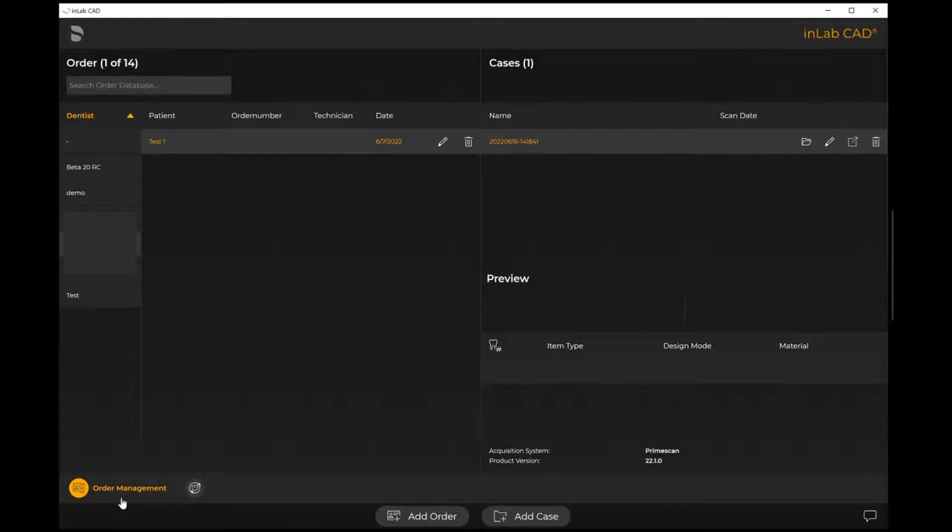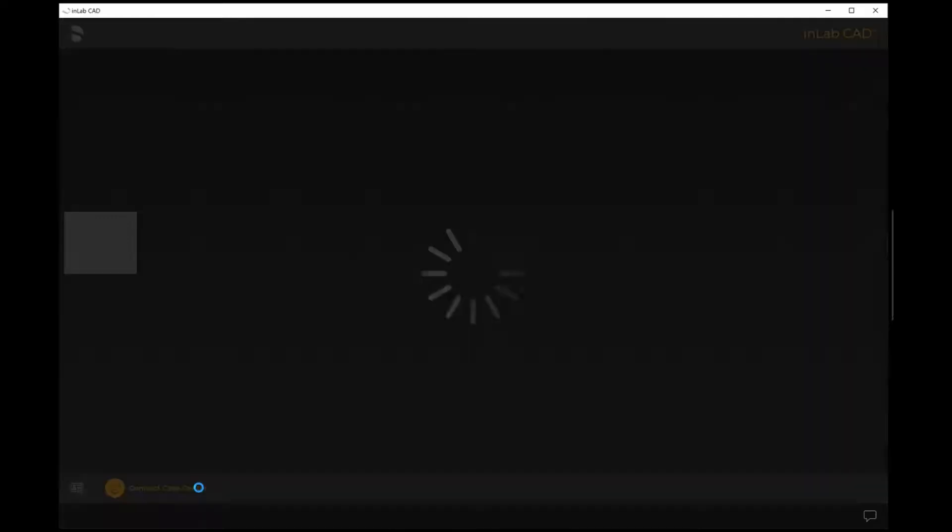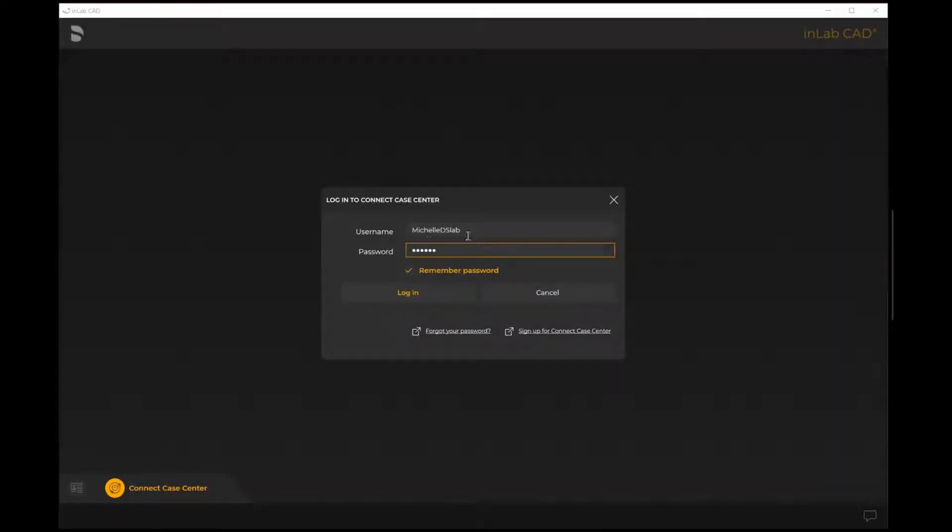Next to the order management window, this little icon right here is now where the Connect Case Center portal icon is located. If you select the icon itself, it will take you to the login screen where you will have to identify your username and your password.